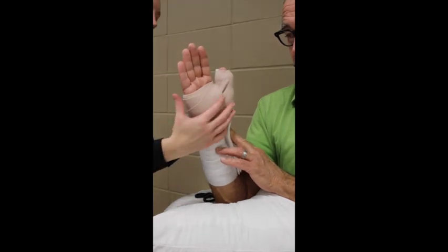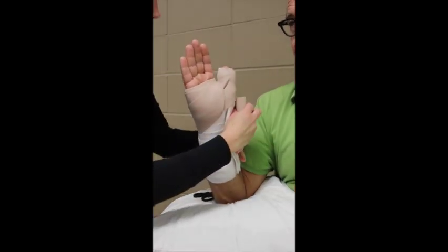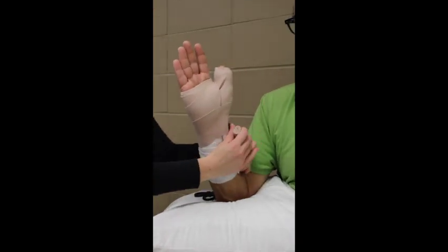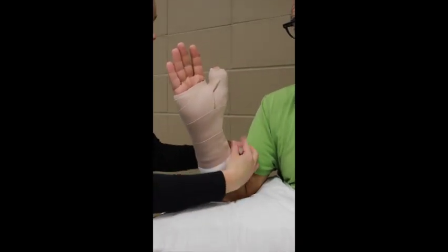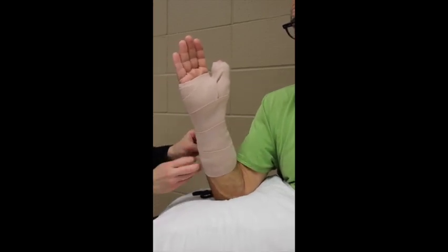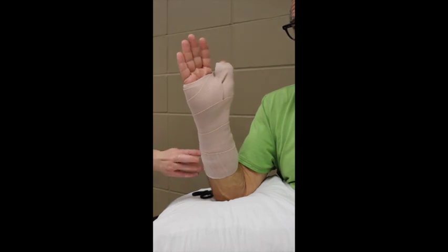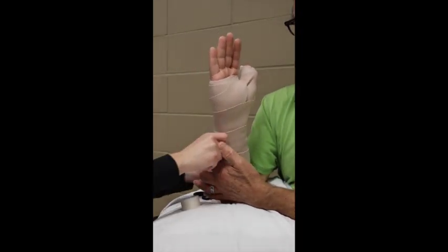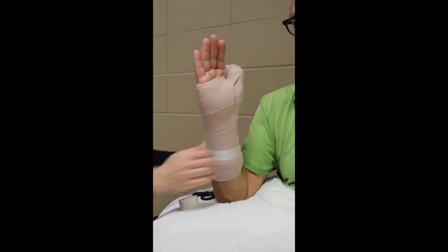Making sure to look at any tails and fold any raw edges — this has to look good and it has to serve a purpose. Overlap by about 50%. Our goal is to use one ace wrap for a short arm splint and then use tape to hold it in place.